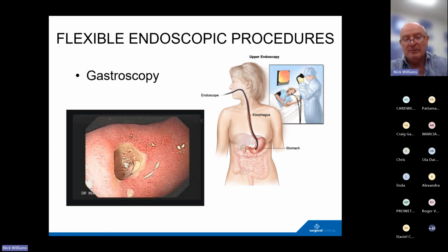So one of the very basic, simple ones, says what it does on the tin. Gastroscopy goes into the stomach. So very simple intubation of the scope in through the esophagus. Sorry, that's an American spelling of esophagus, and into the stomach. They'll usually do the first part of the duodenum as well, and that's an example of a through-the-scope view with an ulcer.